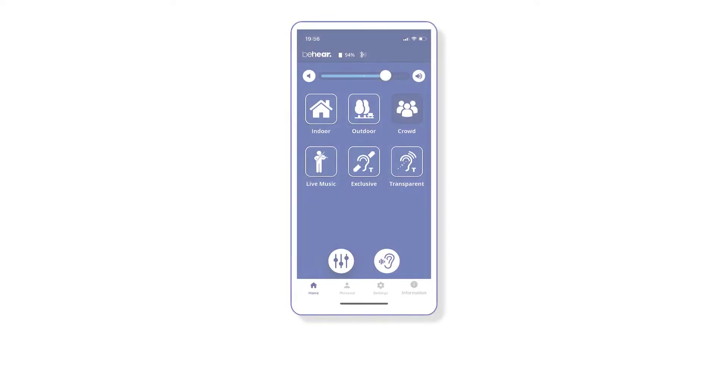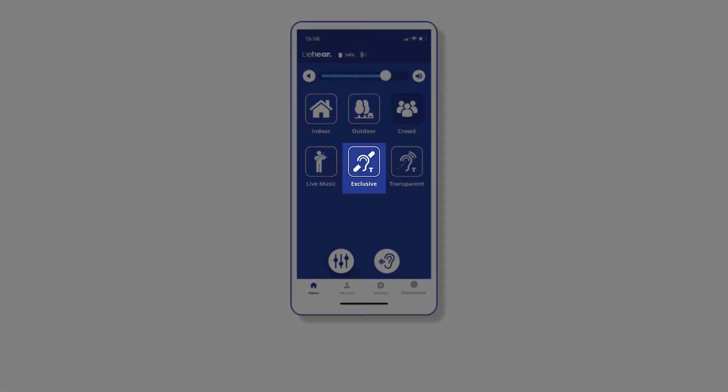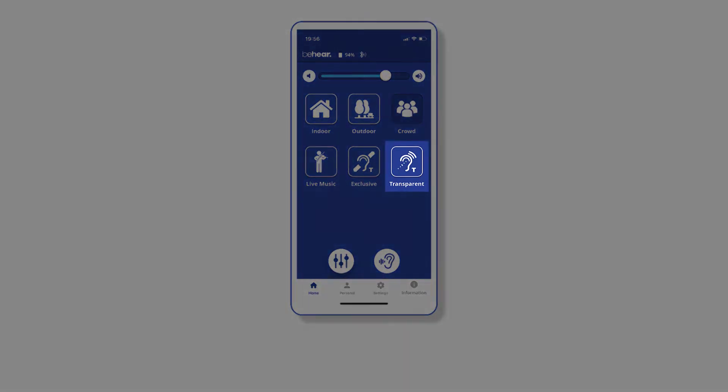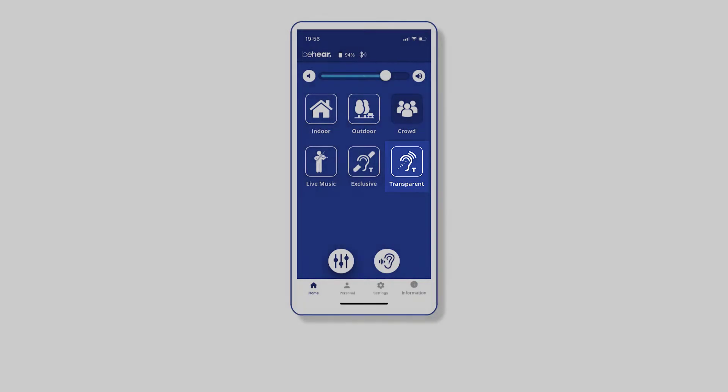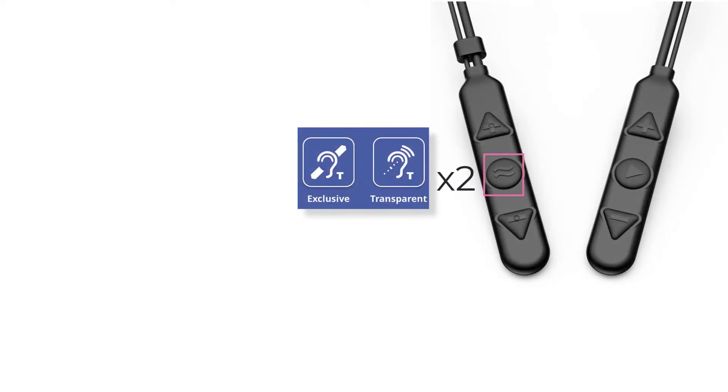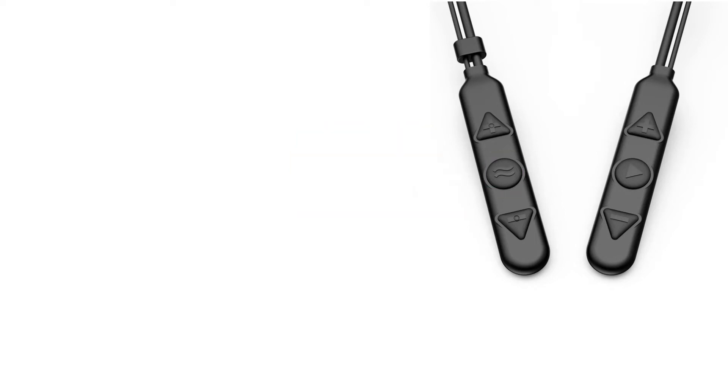When you want to hear only the sound source being transmitted via the loop, choose Telecoil Exclusive mode. When you would like to hear both the sound source and nearby conversations or other important sounds, choose Telecoil Transparent mode. To access Telecoil modes, double-click the middle button. Single-click to switch between Exclusive and Transparent modes. Double-click again to return to basic hearing modes.